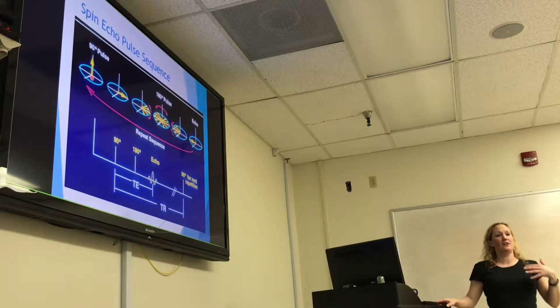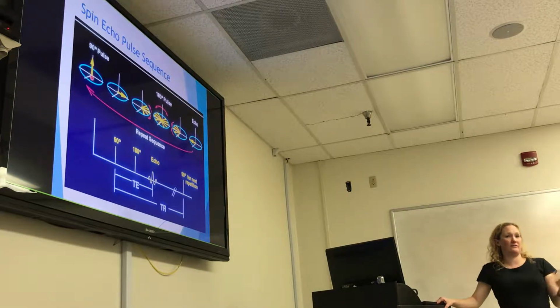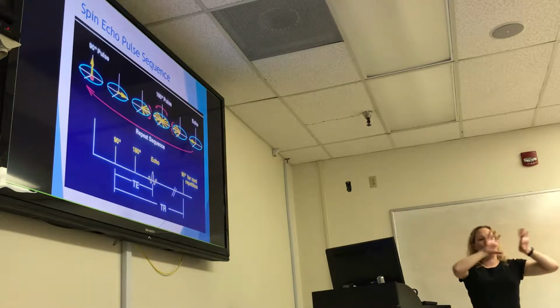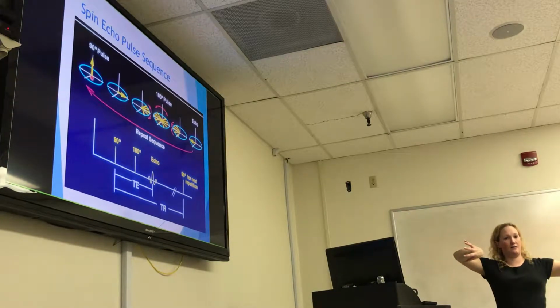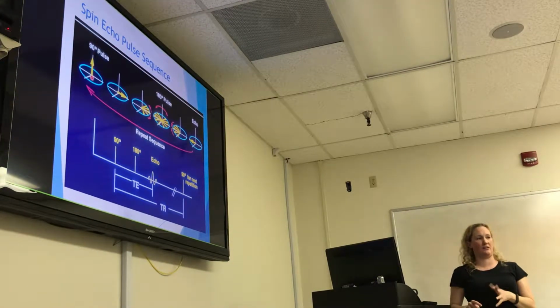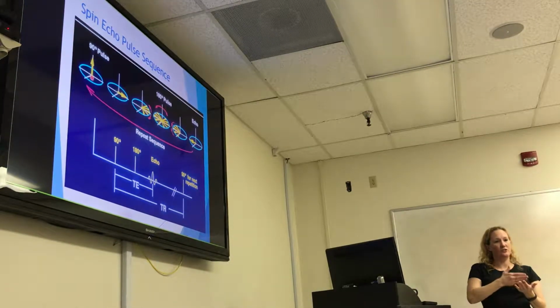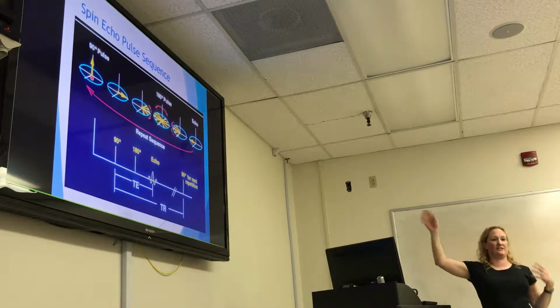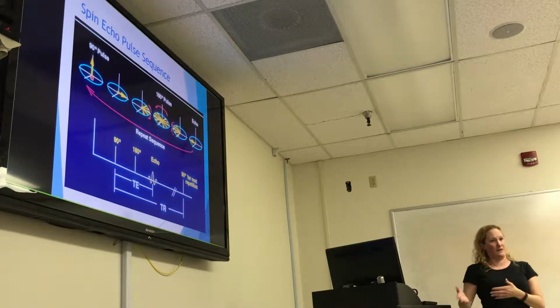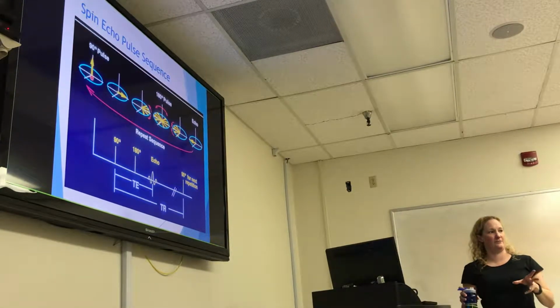It's just going to depend on the protocols that are at your particular facility. Time is always a factor that you might choose one over the other, but try to think of the sequences and the weighting as two separate things, okay? You can get the weighting with most types of sequences other than the more specific ones like a diffusion or something, but I just want to make sure that you're clear that you can use a spin echo for any of those types of weighting. It's not specific to one. It's just whatever parameters you choose that determine what type of weighting you get. Is that clear to everybody? Hopefully you're starting to see that in clinic now and it's making more sense.